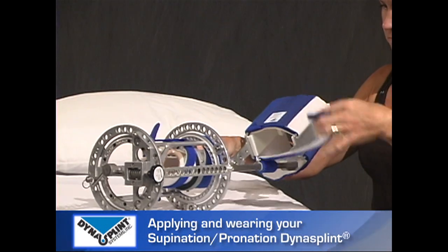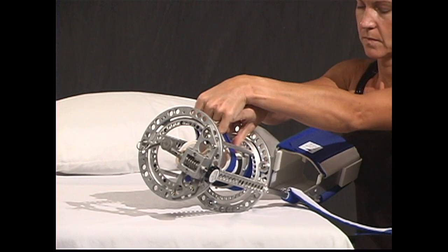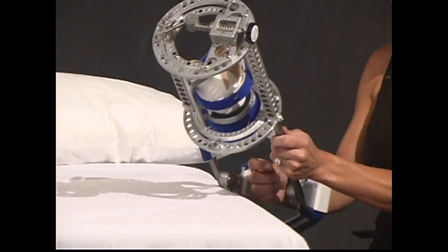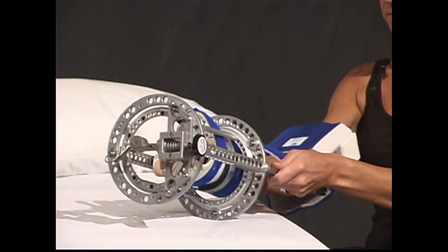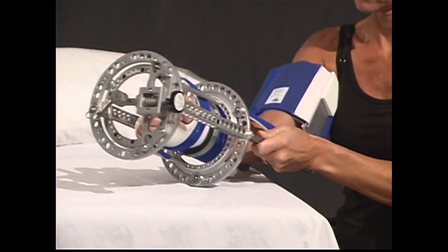In order to apply your Supination Pronation DynaSplint, open or loosen the back of upper arm cuff and the straps on the forearm and wrist stabilizer. Next, slide your arm all the way into your DynaSplint until your thumb is seated through the wrist stabilizer.